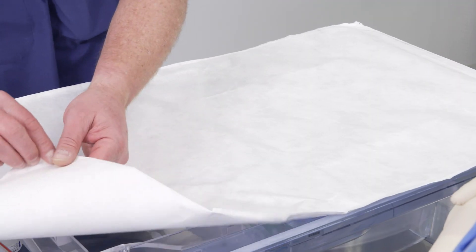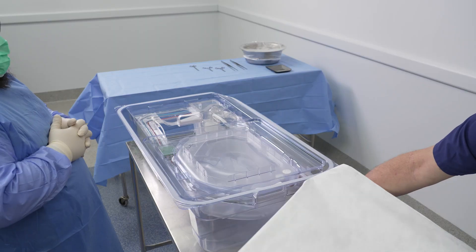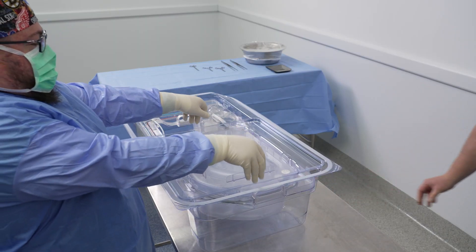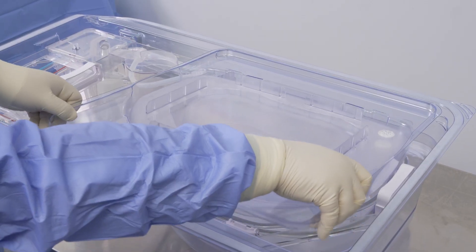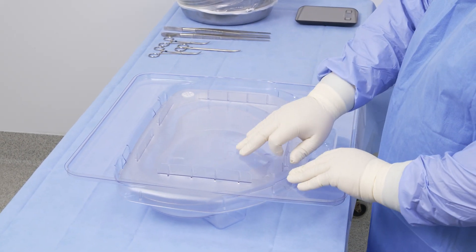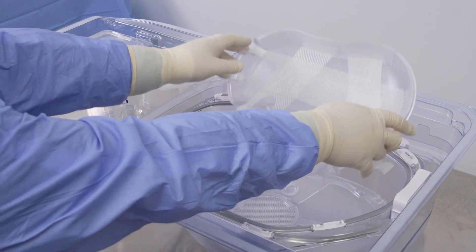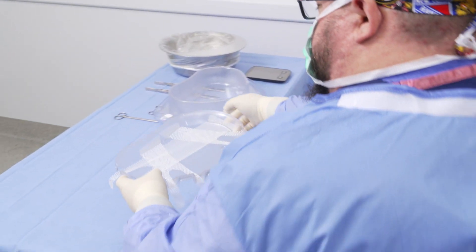Using standard aseptic technique, peel back the Tyvek cover on the perfusion circuit and remove the package retainer containing the perfusion circuit lids and place the lids onto a sterile field. Discard the retainer. Remove the liver cradle from inside the organ chamber and set aside within the sterile field.